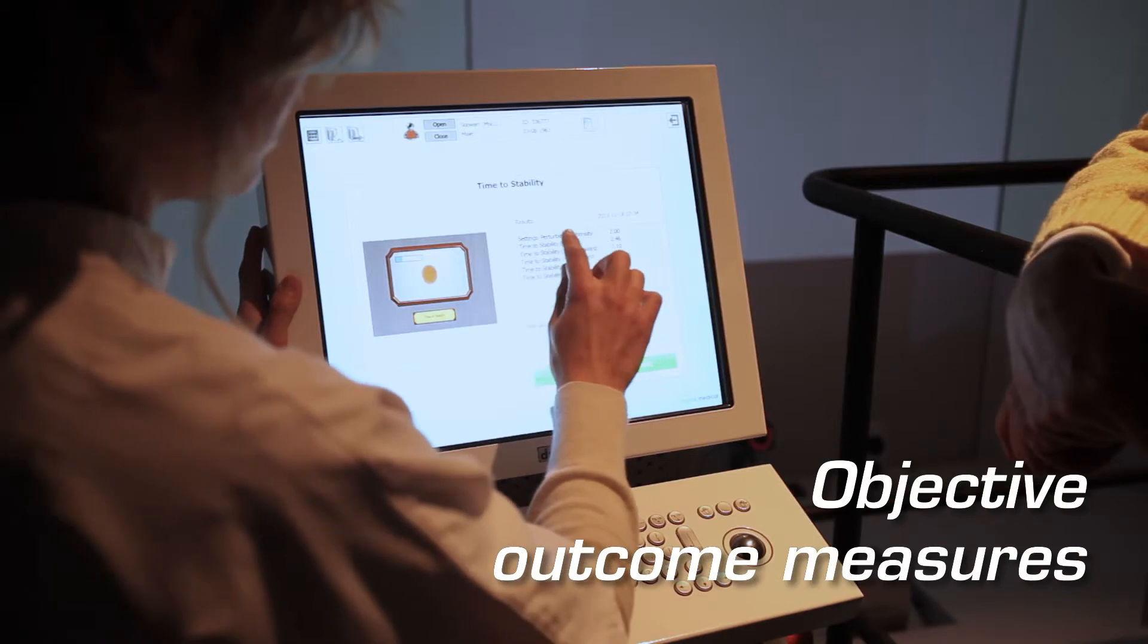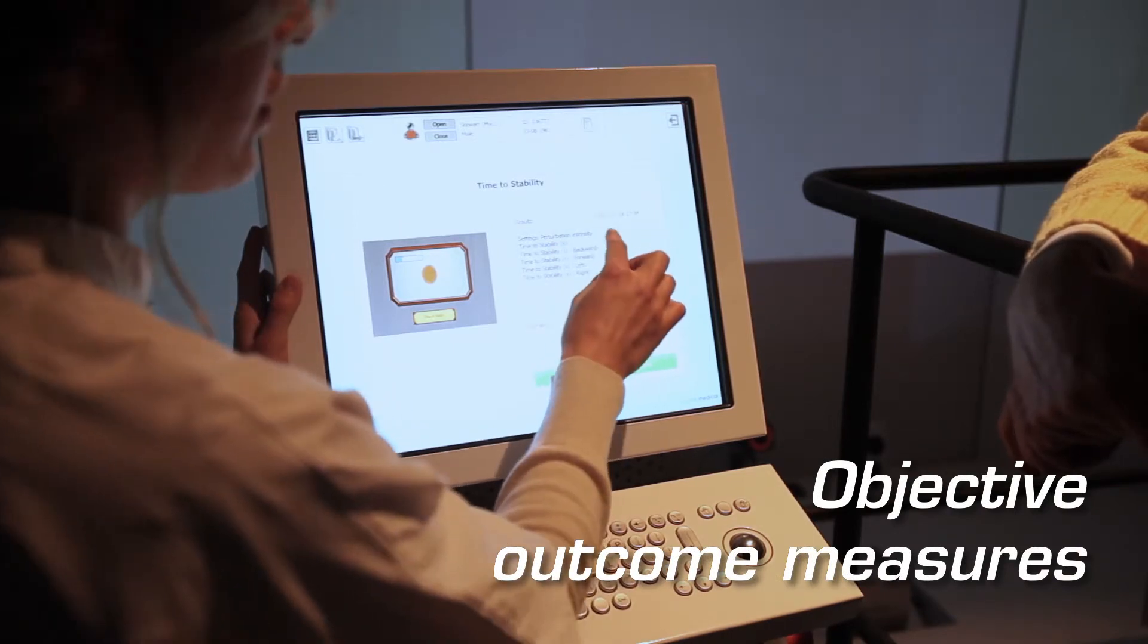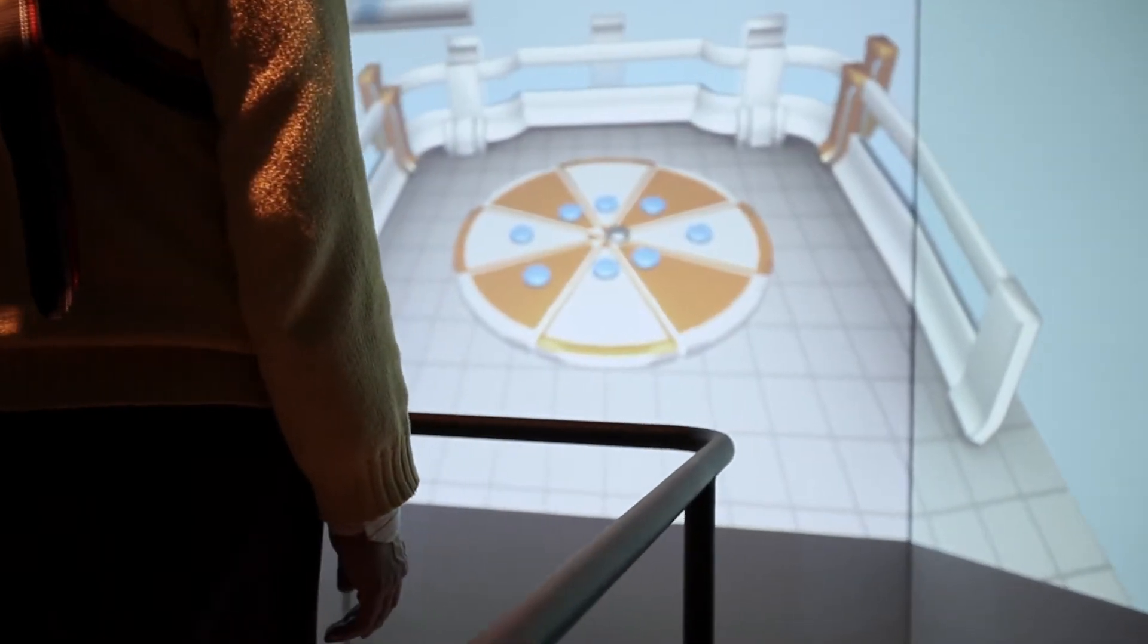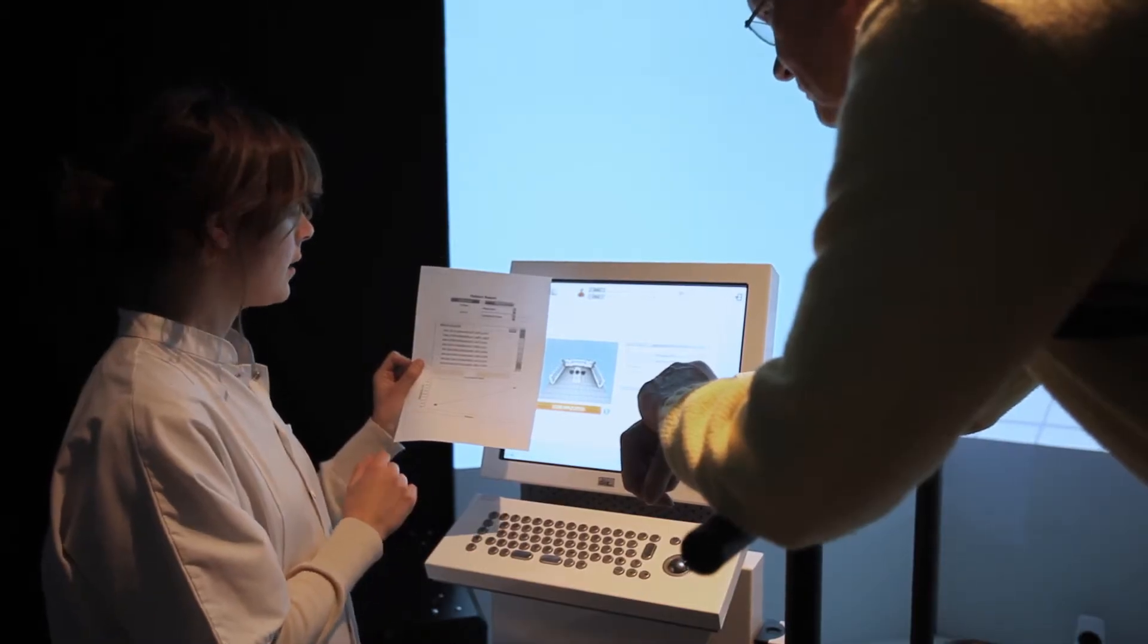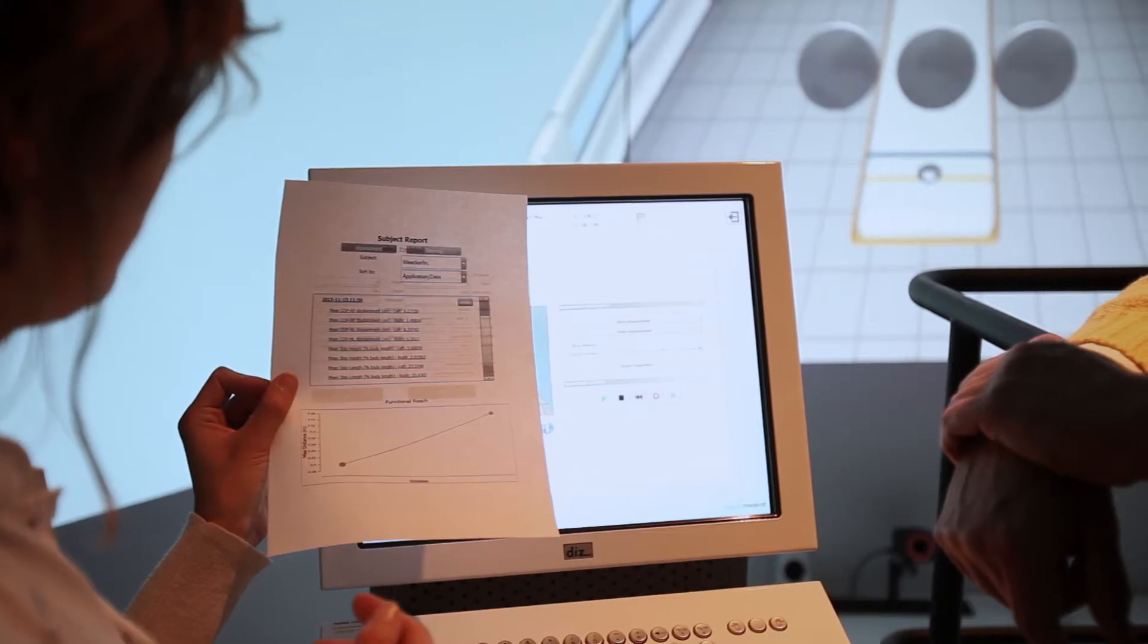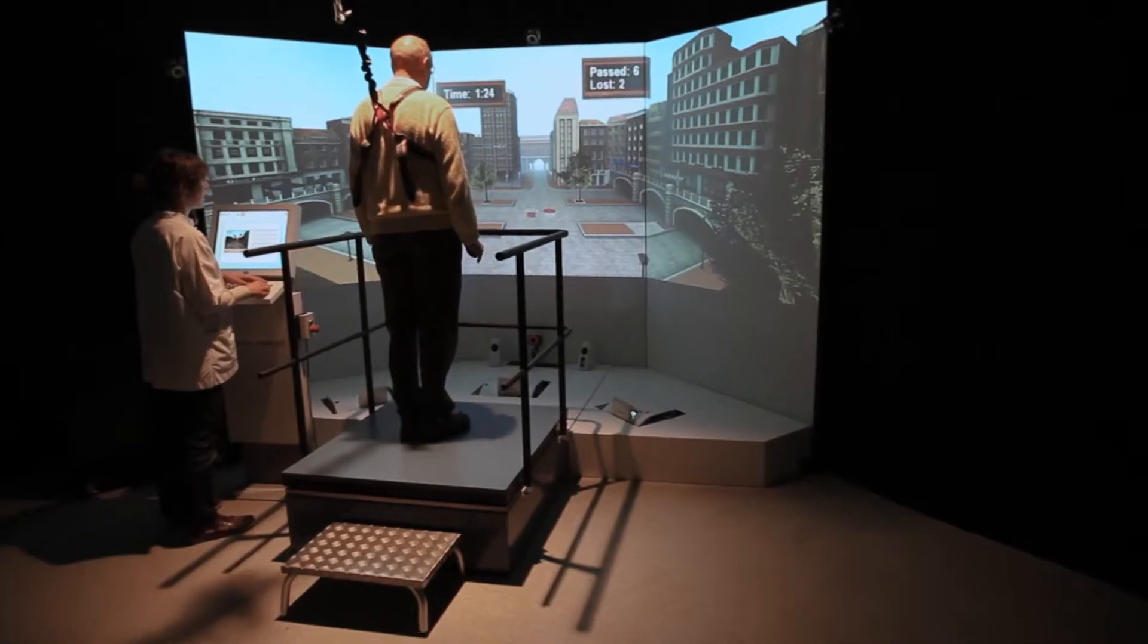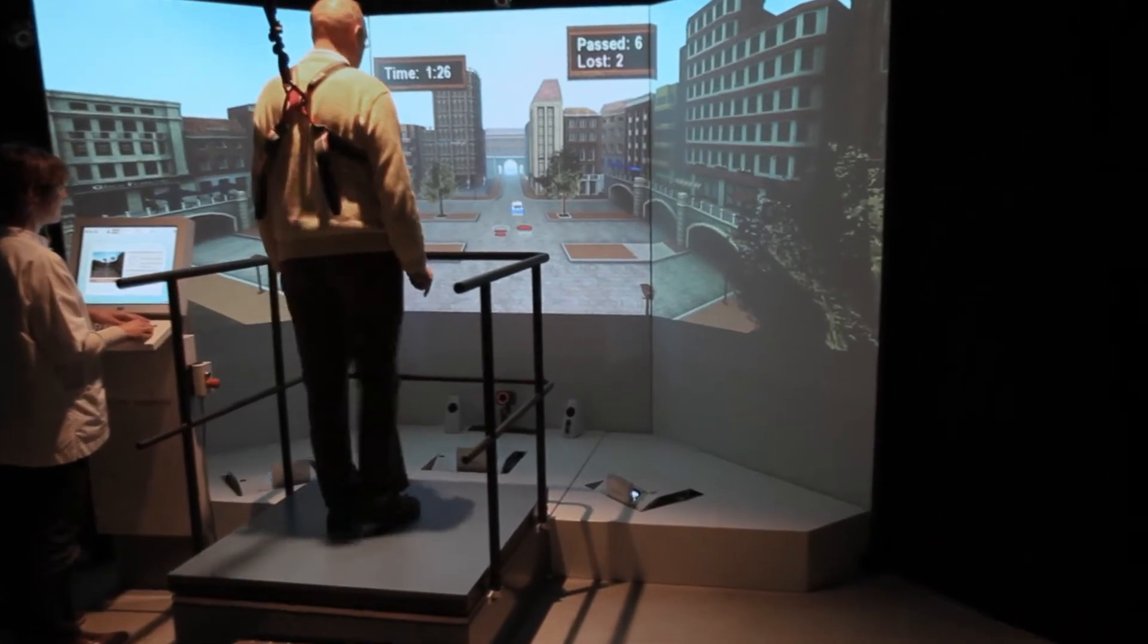The assessments provide you with objective outcome measures for the different aspects of impaired balance control to be used as a starting point for your therapy or to monitor progression. Various VR training games are available.